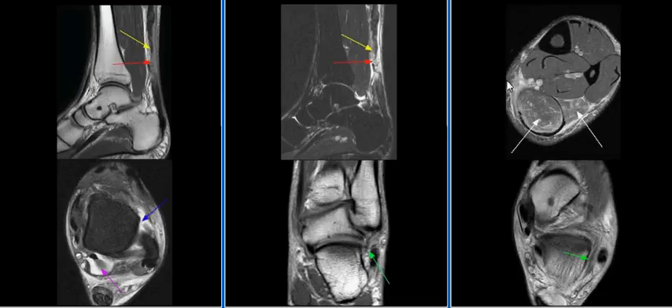There is mild strain of the distal soleus muscle. The anterior talofibular ligament is torn, as seen on this image with the blue arrow. There is scarring of the calcaneofibular ligament, as seen on these images with green arrows.